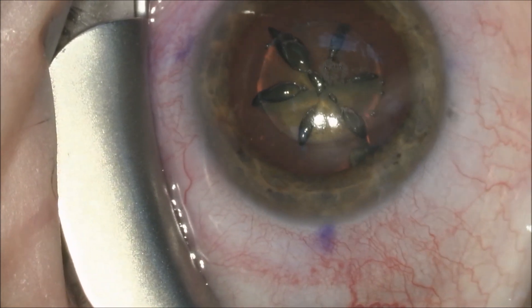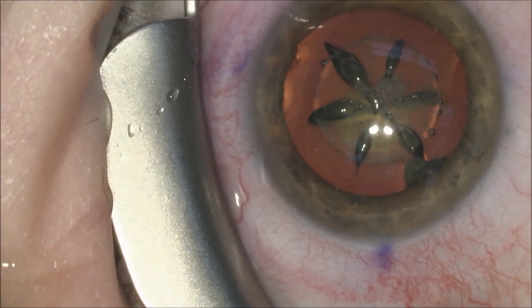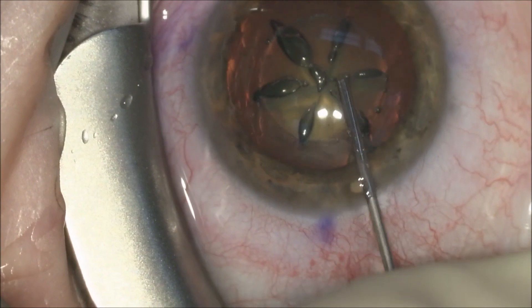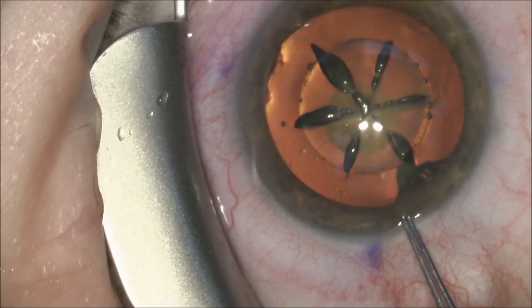Once this has been completed, we will inject Shugarcaine to provide anesthesia and also maintain pupil dilation. We're very careful when we put in our dispersive viscoelastic to go over the previously made capsulotomy with the laser.